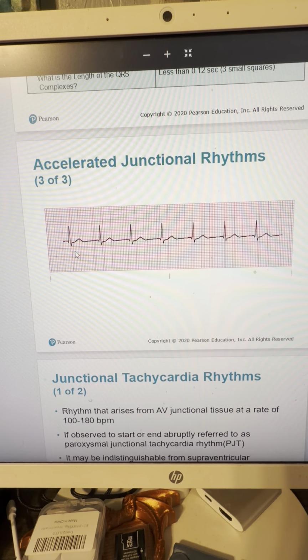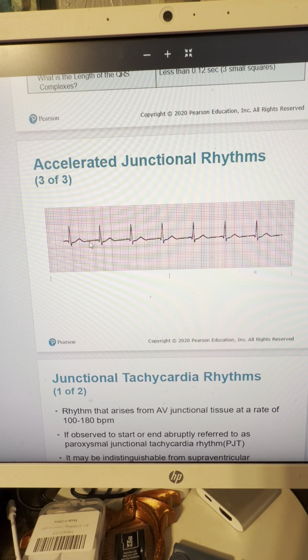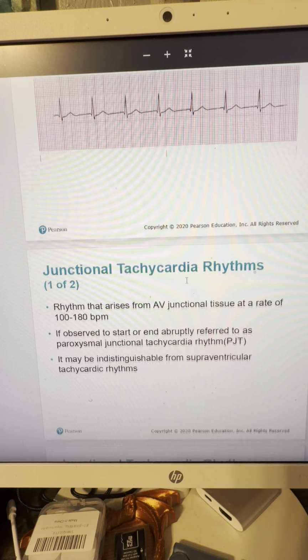And so the only difference between this rhythm and the last rhythm is we can't really see the whole thing here, but if you go here, there is no P wave. So it's going to be in here. Your P waves will always get covered up in a QRS because it's higher amplitude, bigger electricity. So no P wave, nice tight narrow QRS, repolarization, and they continue. This rate is 1, 2, 3, 4, 5, 6, 70-ish, probably 80 if they finished it out, because here are 3-second marks. So this is just shy of 6 seconds, but it's above that 60 mark and below 100.